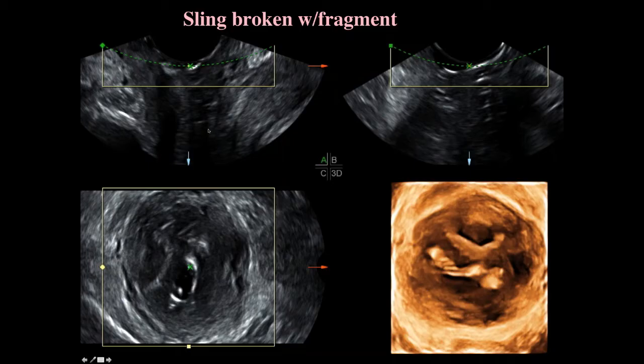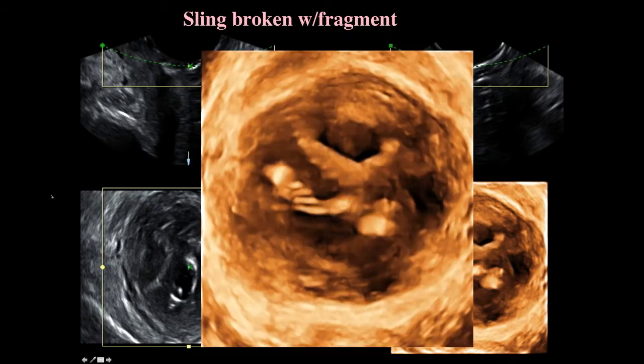So it's important when you look at this in 3D to have all of your views up, because this shows you what the floor of the pelvis looks like, but this shows you what level you're at, because you can see the sling is quite low here, that it's not up here where you might think it should be. And here's the broken sling.